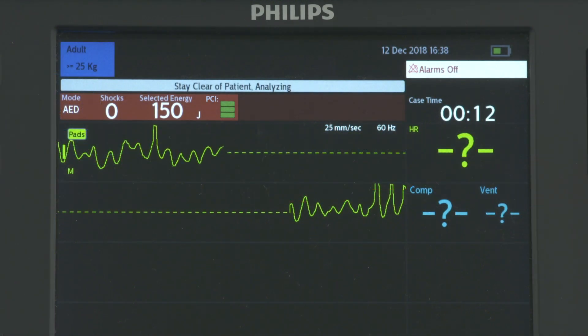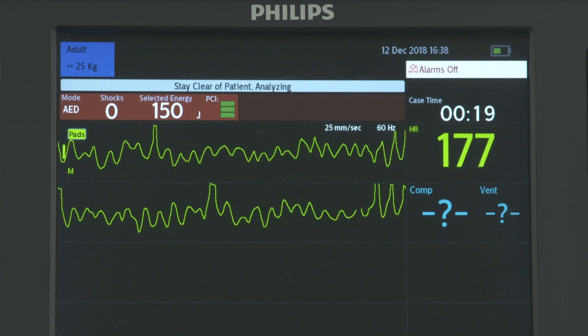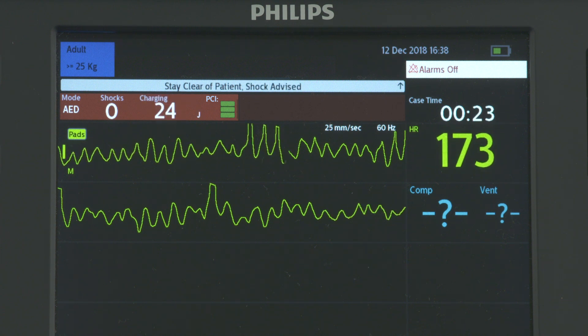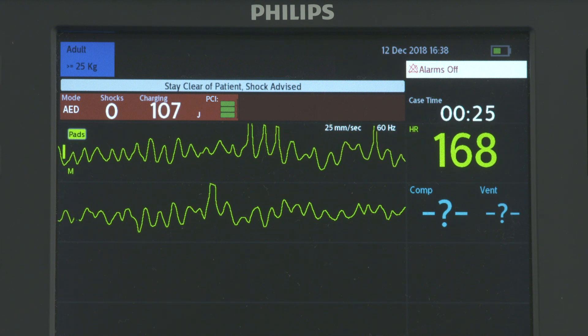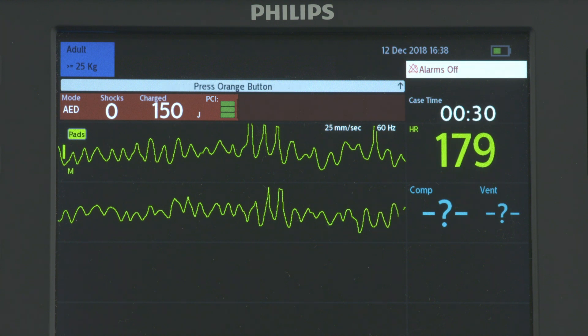The HeartStart Intrepid analyzes the heart rhythm and announces if a shock is advised. It automatically charges to 150 joules if the adult patient category is selected, or 50 joules if the infant-child category is selected.